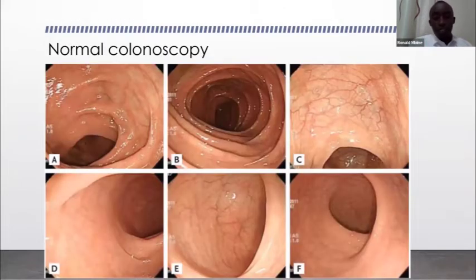So this is an image of how a colon looks on colonoscopy. It doesn't look as bad as most people would expect. Here, you can see it's a nice clean colon because we've given the person medicine to clean that colon. And you can visualize even a tiny, small swelling, what we call polyps. I don't want to share pictures that have scary diseases, so I'll only share what is normal. But at least with the colonoscopy, we are able to capture most of the colon diseases.